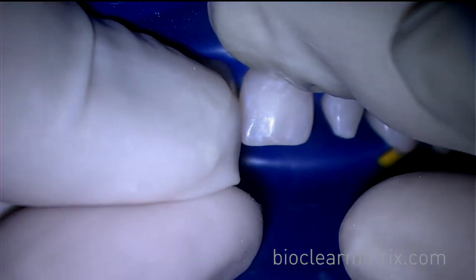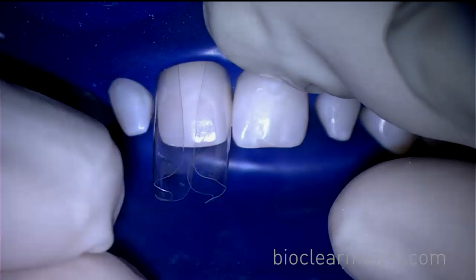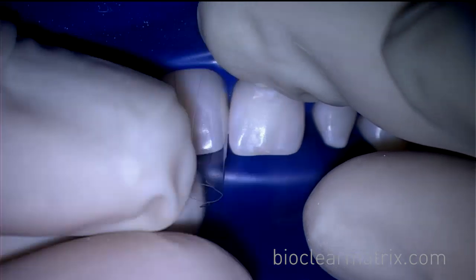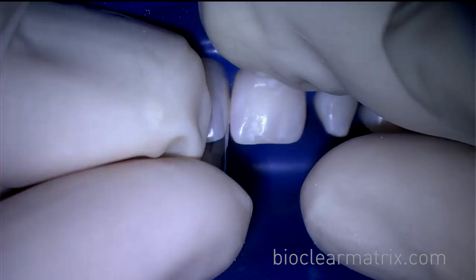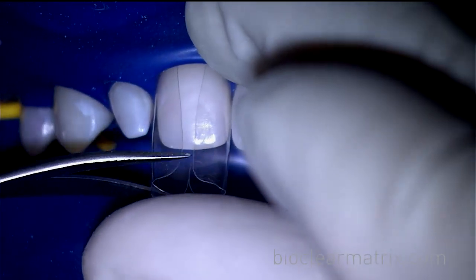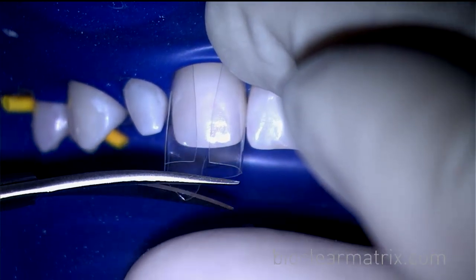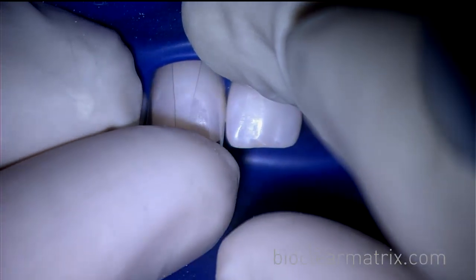After inserting the trimmed matrices, Dr. Clark uses slow, gentle pressure to help the matrix seat further apically. After doing this, you can then trim off the incisal portion to create a wider opening.